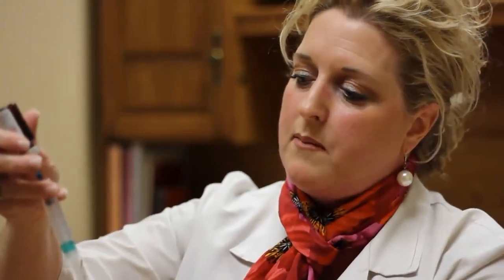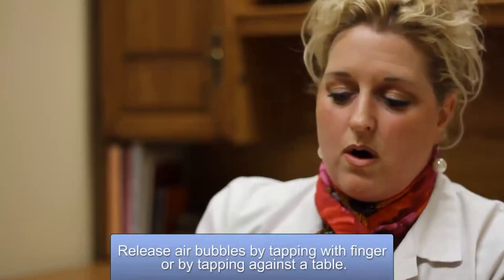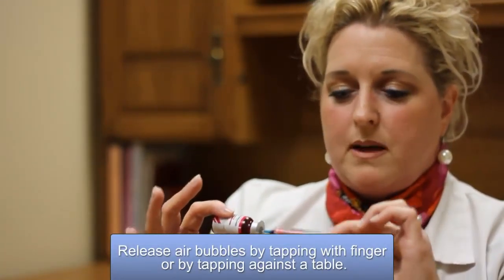Now you're ready to withdraw the medication. Simply turn the bottle upside down and hold your syringe. Everyone is going to develop their own technique. I grasp the syringe with my pinky and fourth digit, stabilizing it, and pull the plunger back past the 1. The reason for that is you'll probably have an air bubble at the top of the syringe, so draw out more than you need and then push it back up to the 1, which pushes the air bubble out. If you still have air bubbles, take your finger and tap the syringe, or tap it on the side of a table to bring those bubbles to the surface. Then pull the syringe straight back out.